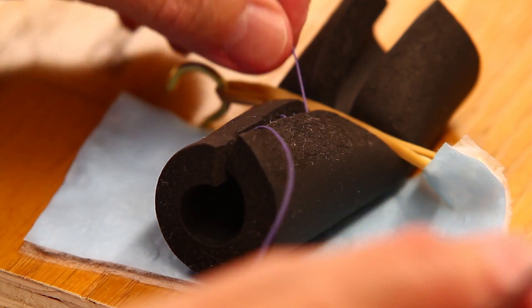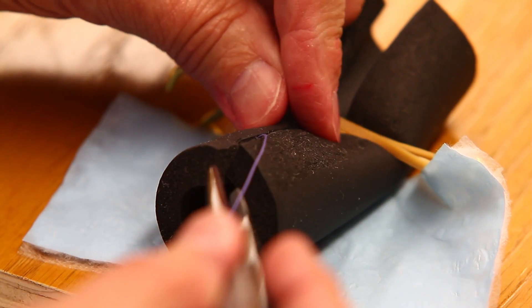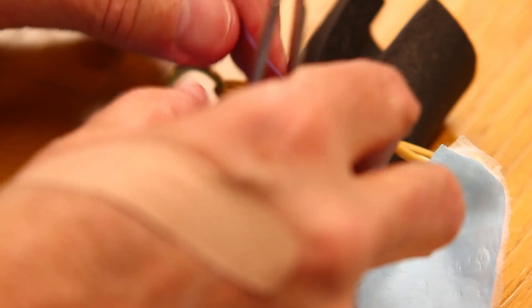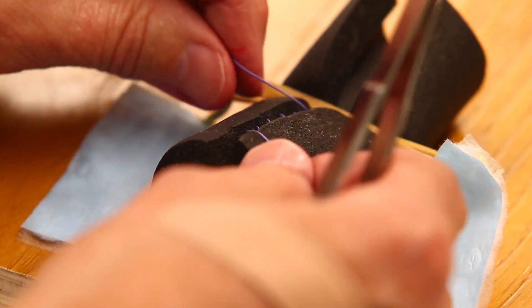Okay, and we would have tied the initial one of course, and we would tie the last one. But this demonstrates the closure of a delicate tissue area.